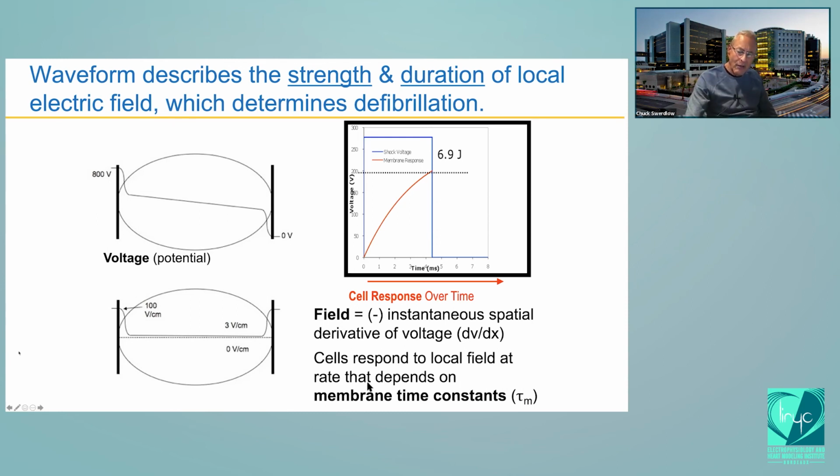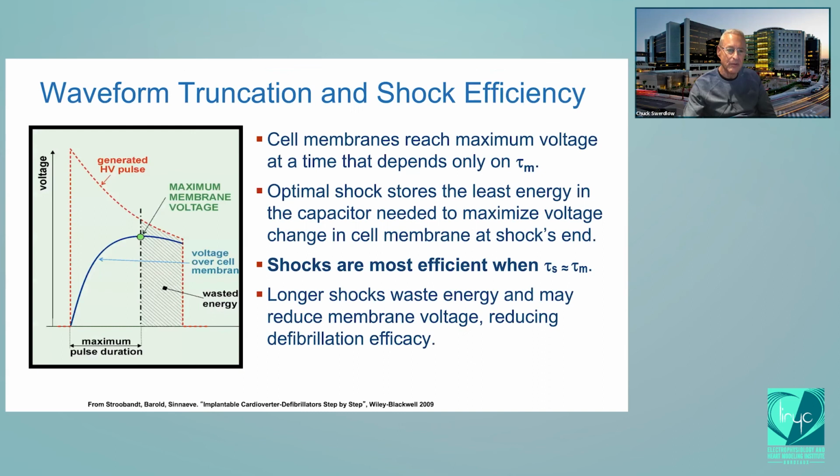We call the time at which the cell can respond the membrane time constant. There's a membrane time constant for completely repolarized cells, which is the one we use for pacing, and a membrane time constant for partially depolarized cells, which is what we use for defibrillation.